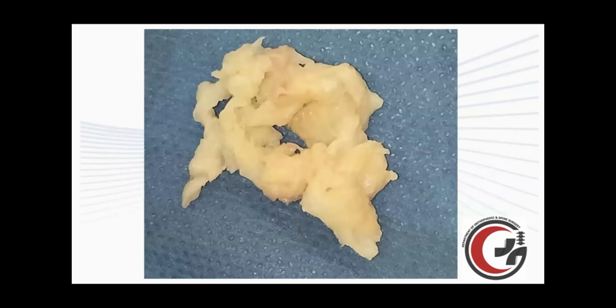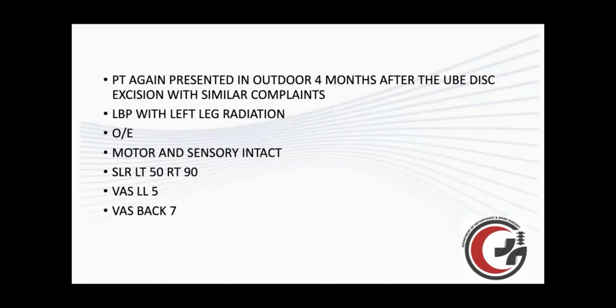And this time we were able to retrieve the remaining segments of the disc, which was left initially. So this patient presented to us. On the first post-operative day, she was fine, and on the 6 weeks follow-up, she was doing well.